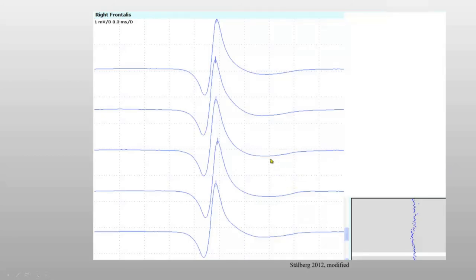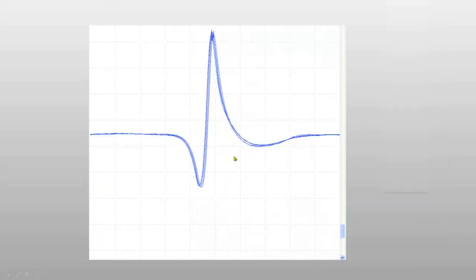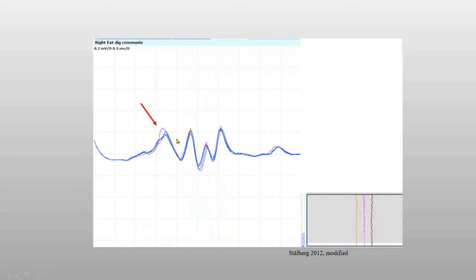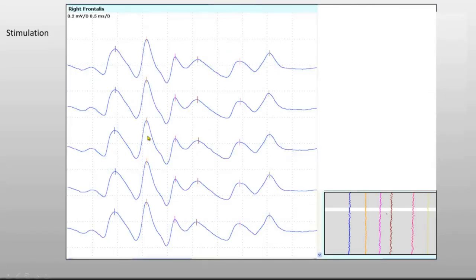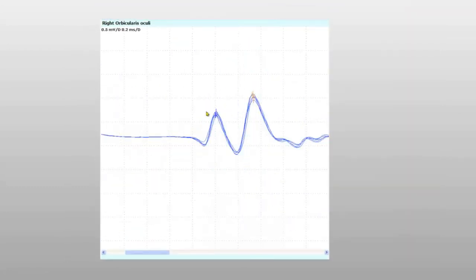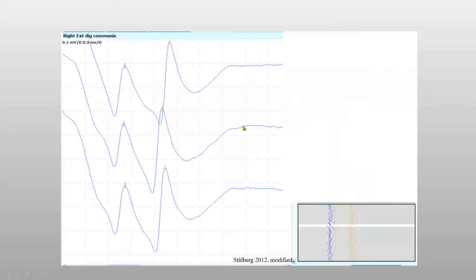Here are some examples in raster mode and superimposed. One recording shows four spikes but the lines are not parallel, so it is not a valid recording. Another shows multiple spikes, and on superimposition some are nice with parallel rising phases while others are not parallel or have disturbance in the peak — those two are skipped. Another recording looks nice but on closer inspection both signals actually have a summation pattern.